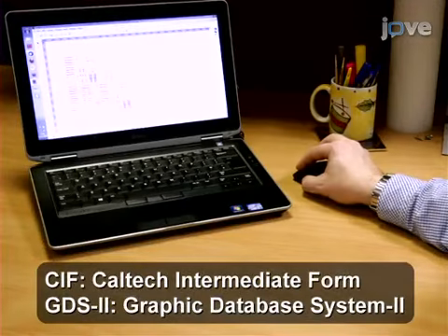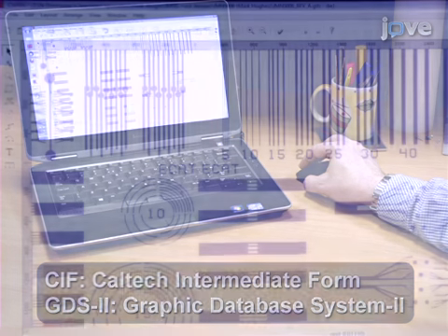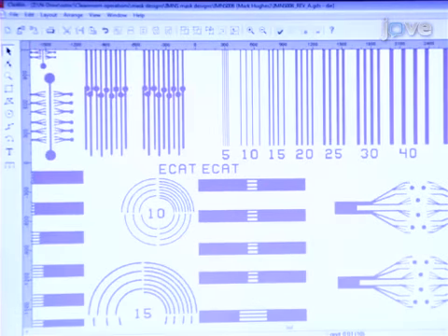To design the desired Parylene-C configuration, use a layout editor software package that is capable of reading and writing CIF or GDS2 files. Outsource photomask manufacture to an appropriate microelectronics facility, or make in-house if facilities exist.